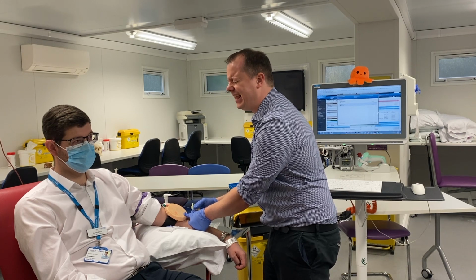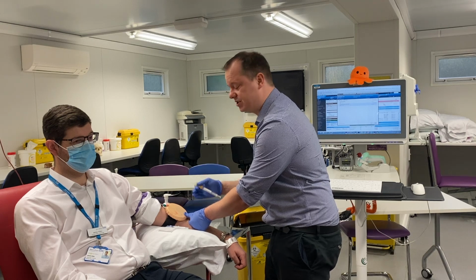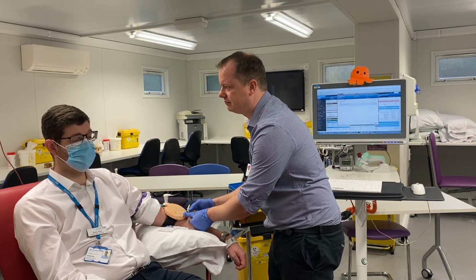That is absolutely key to getting a needle into any vein, is making sure that you anchor the skin and perform what we call skin traction. I'm then going to warn the patient. I'm just going to insert the needle now, and I'm going to move the needle into the vein. The patient didn't feel anything.